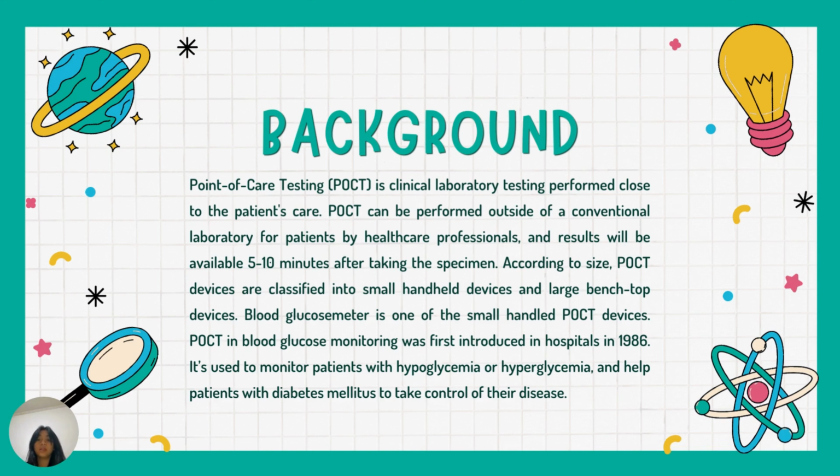POCT in blood glucose monitoring was first introduced in hospitals in 1986. It is used to monitor patients with hypoglycemia or hyperglycemia and help patients with diabetes mellitus to take control of their disease. That's all from me.